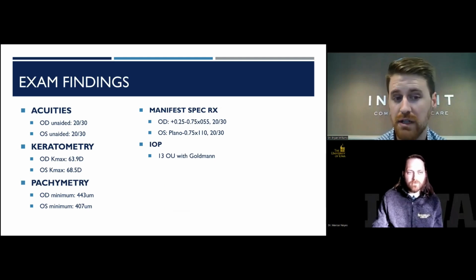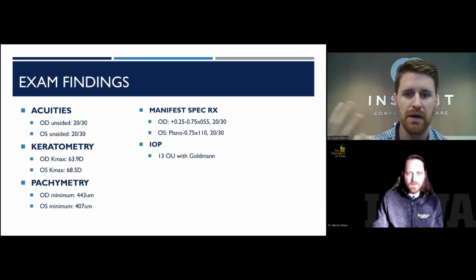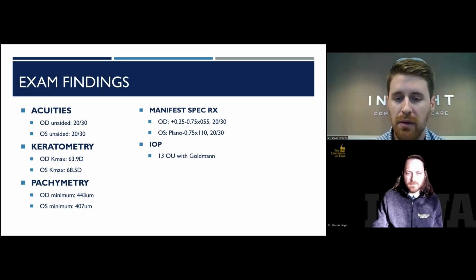Vision wise, unaided she's seeing pretty well. So this isn't one of those huge wow factors for patients of putting on a lens and saying, oh my goodness, my vision is much better. But even in this case, by stabilizing some of that ocular surface disease with a lens, she was able to see a whole lot better just with the quality of her vision. So not a whole lot of a spectacle prescription there.